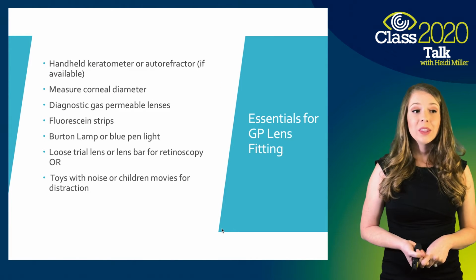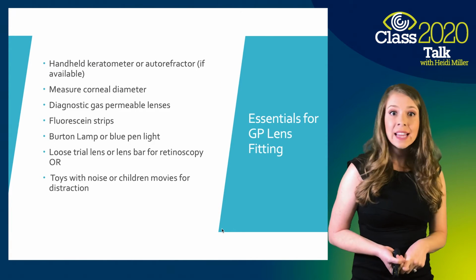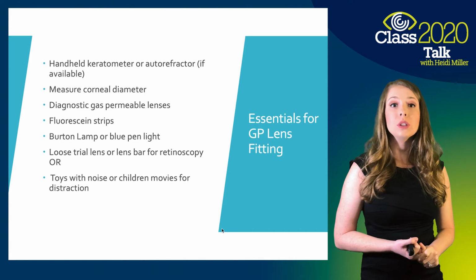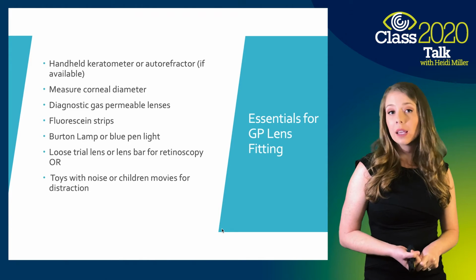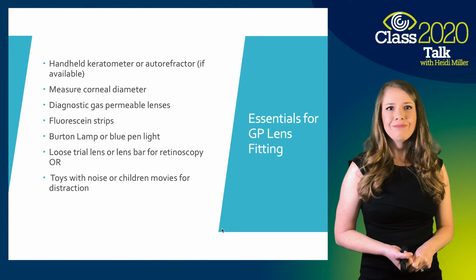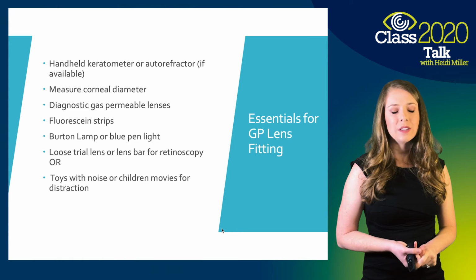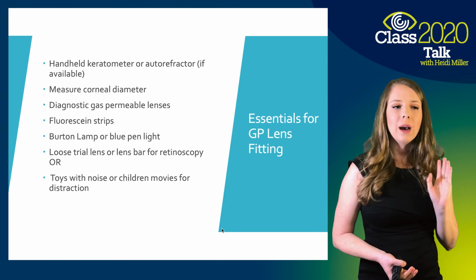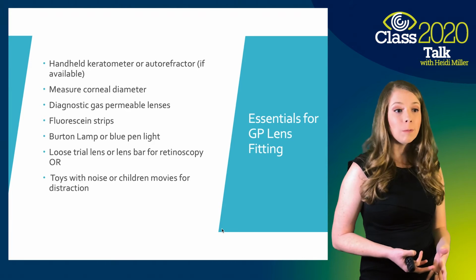Some essentials for GP lens fitting. You don't have to have a handheld keratometer or autorefractor. However, if you do have something like that in office, that can be beneficial to get some starting point on Ks and starting point on refractive error. I say refractive error because you're going to want to do a diagnostic lens fitting, but for starting point on Ks, that could be helpful.